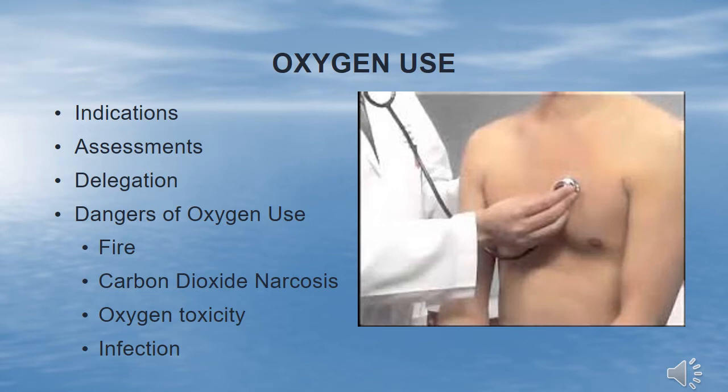Infection can result from oxygen therapy, especially when humidified or nebulized. Oxygen is drying to the mucosa, and moisture is frequently added to prevent damage. Heated nebulization poses the highest risk of infection. The use of disposable, closed systems is best to prevent infection. Sterile or distilled water should be used and changed out daily or according to facility protocol.